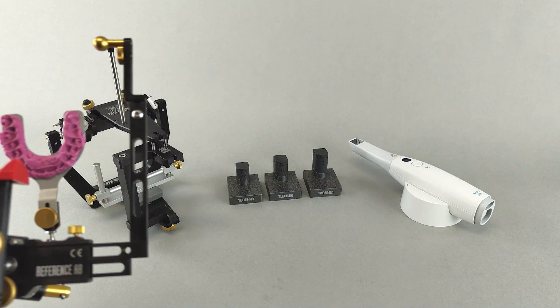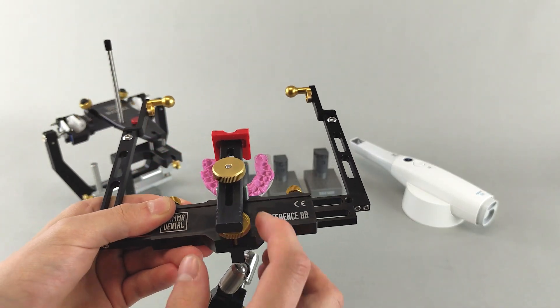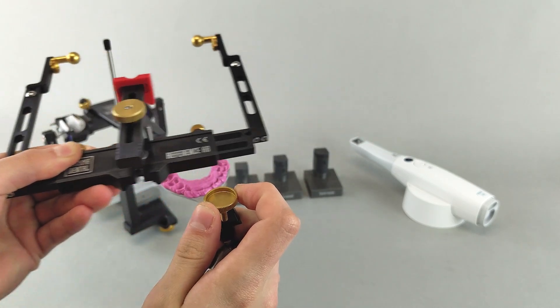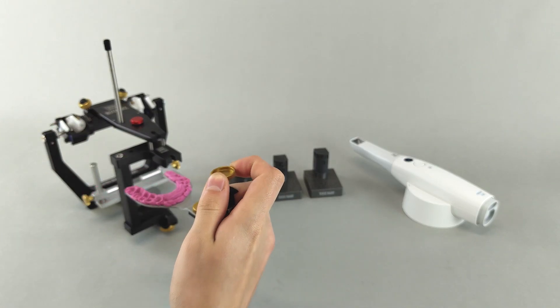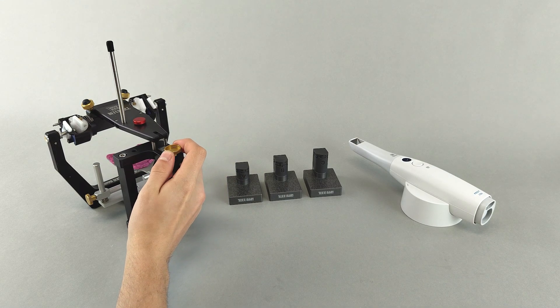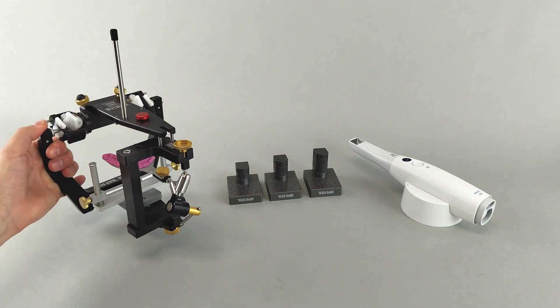After taking a bite registration with the bite fork and the 3D joint support, the best option would be to use transfer stand AB2, which can be mounted in the articulator and receives the 3D joint support with attached bite fork from the face bow. The bite fork is thus correctly positioned relative to the anatomic hinge axis, and you may proceed with the digital workflow.